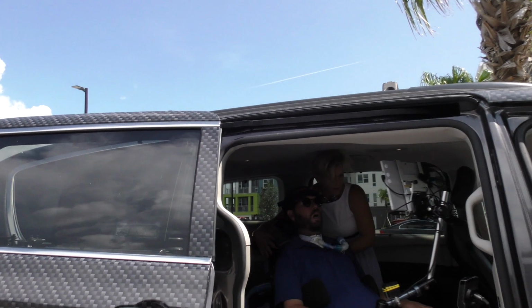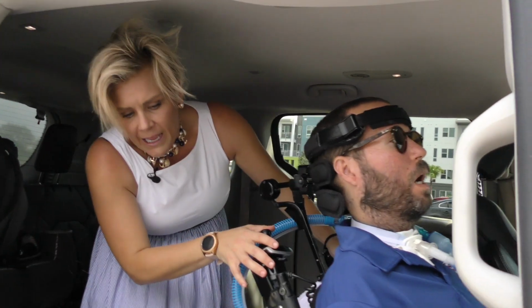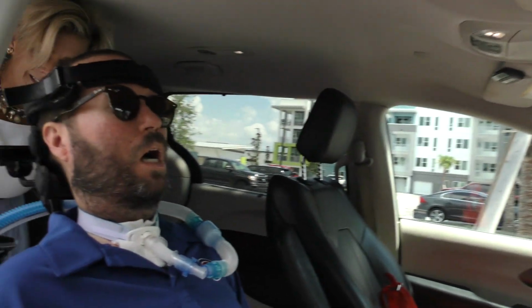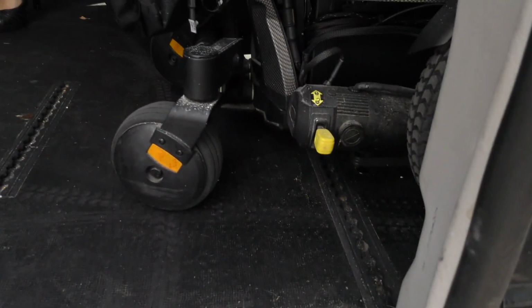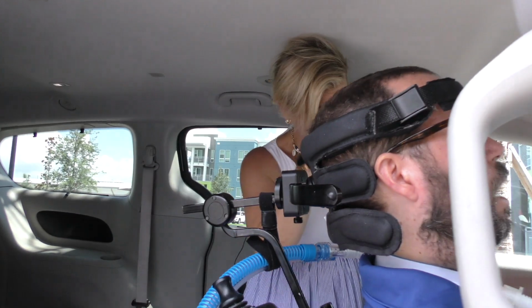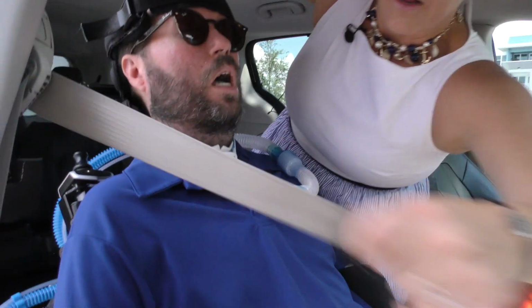The ramp has hydraulics, so it actually tilts down so that it's not such an incline for Kevin to navigate. And then this is our new click-in system, which is perfect because it used to be 4 separate tie-down straps that I would then have to secure in 4 different corners. So this actually is a pin underneath him that just slides him right into the lock. Kevin, buckle up for safety.